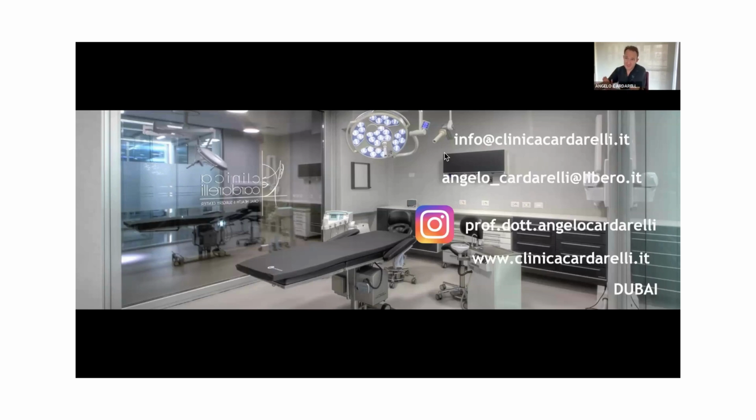This is the last chance for the patient. If I have another option, I will use the other option. Okay? Young patient, no customized implant for sure, bone regeneration. But if we have an old patient, for example, a patient that comes with some previous failure, we can propose the customized implant because this is the last option.